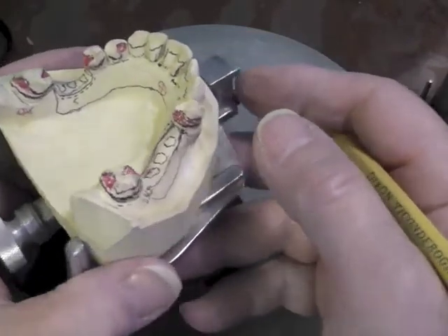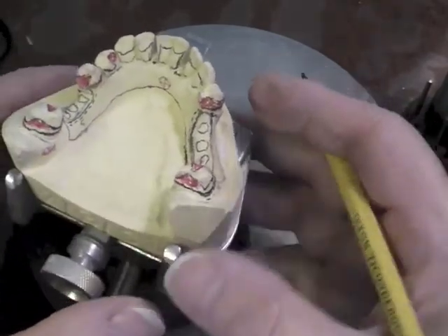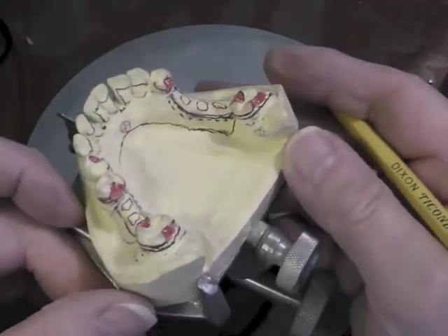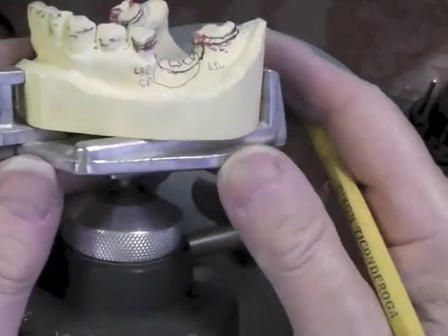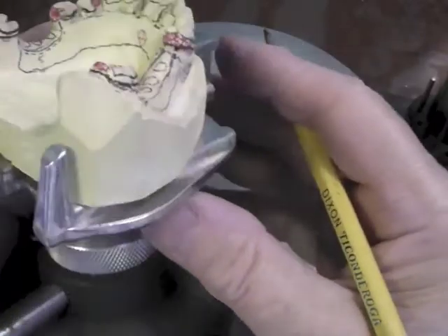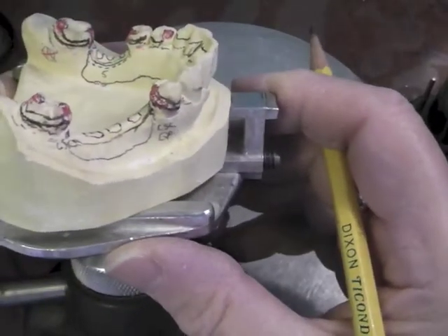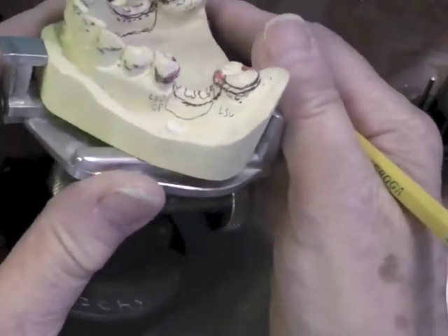These marks show us where we need to adjust our tooth, where we have interferences to fit our design rules — which say that direct retainers have to be the first half to two-thirds above the survey line, and reciprocal components have to be entirely above the survey line.